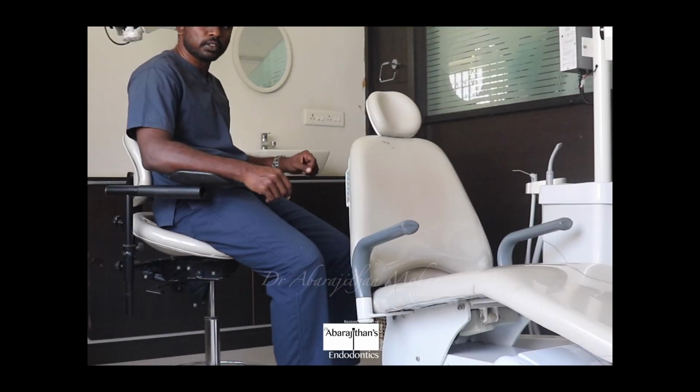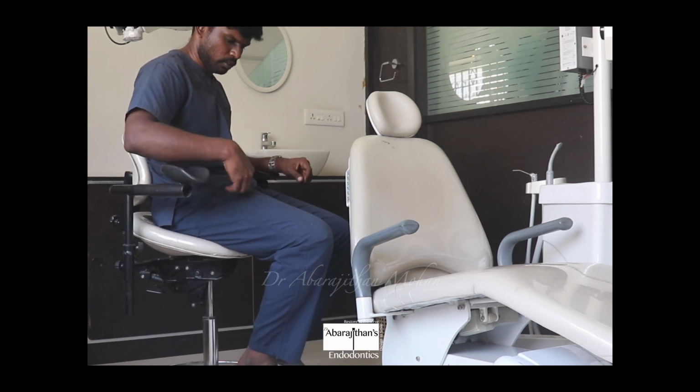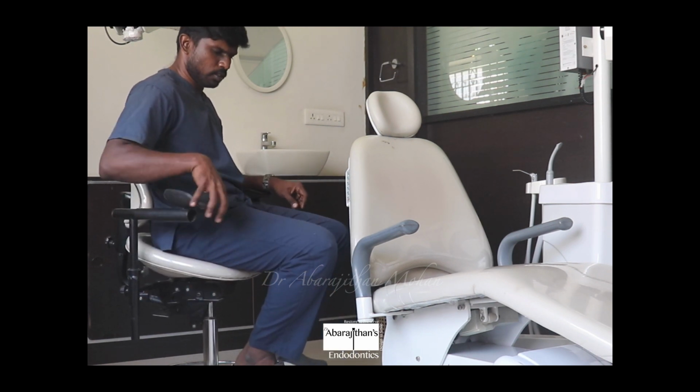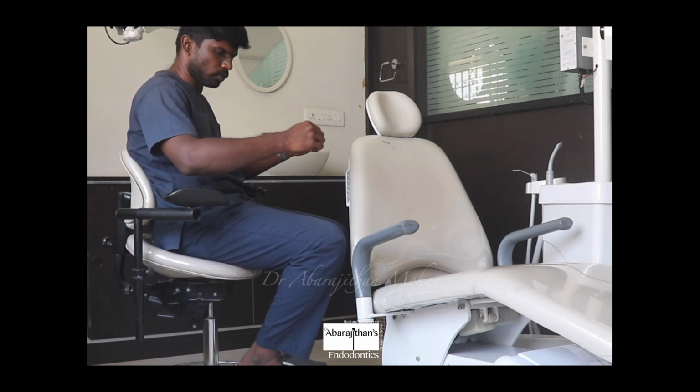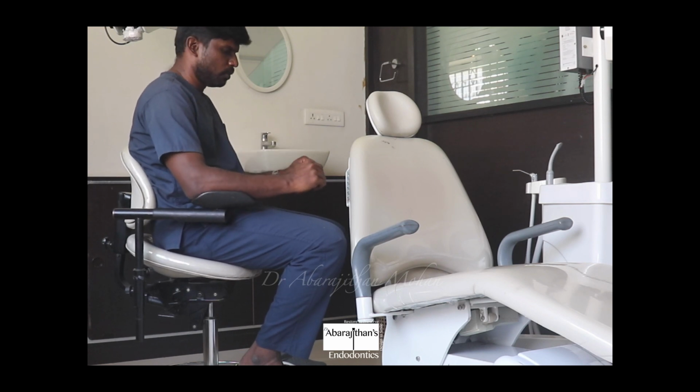So to develop good chair positioning or good ergonomics, first the operator has to position himself ideally on his operator stool. Before even adjusting the patient's chair, the dentist needs to sit on his dental stool, and there are two things that he needs to correct. One is the parallelism of the thigh. The thigh has to be parallel to the floor. And number two is the forearm, that is from the elbow to the wrist, also needs to be parallel to the floor. This is the first adjustment that a dentist should make.